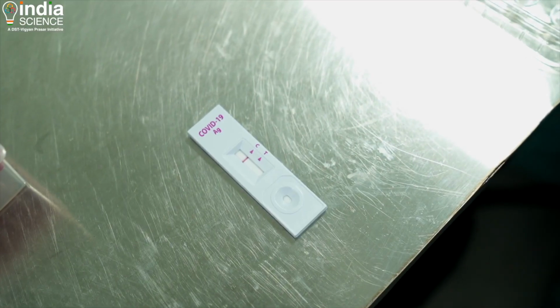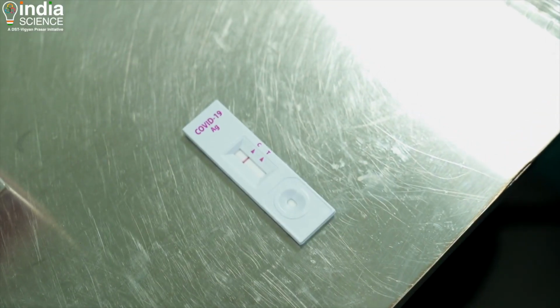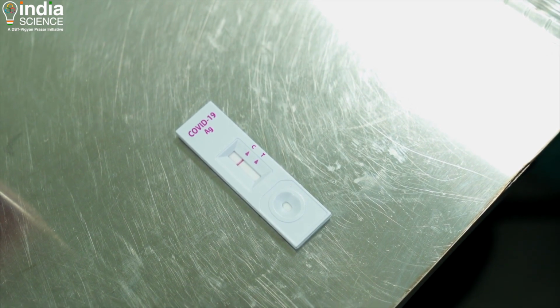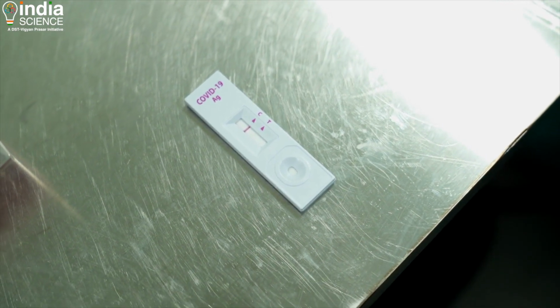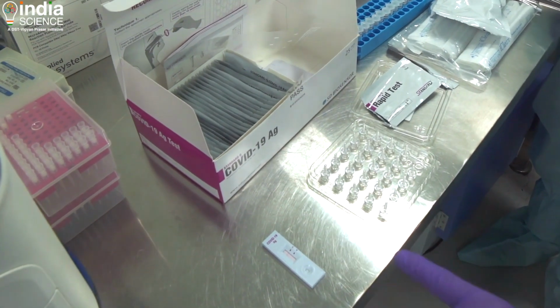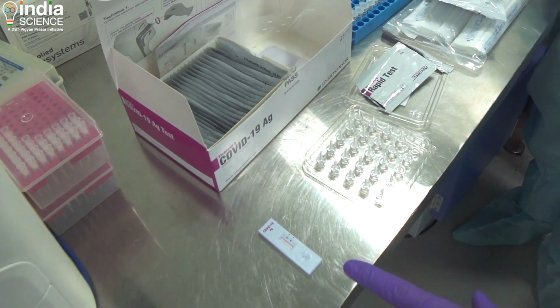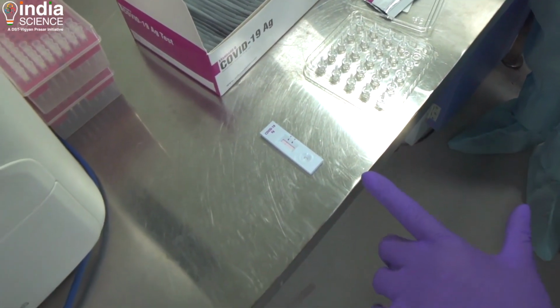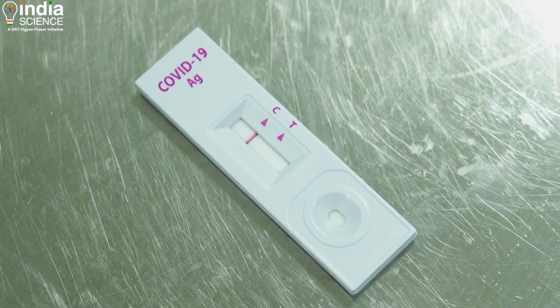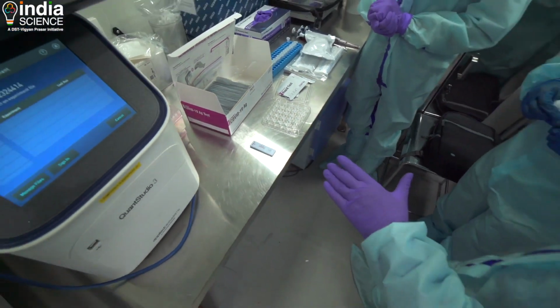So do you see the band now clearly? Yes, there is a band which can be seen. All right. So what you see is there's a clear band at C, which is a control, meaning the kit is working. And since at T, which is the test, there is no band, it shows that this particular sample was negative, meaning it had no COVID-19 antigen in it.